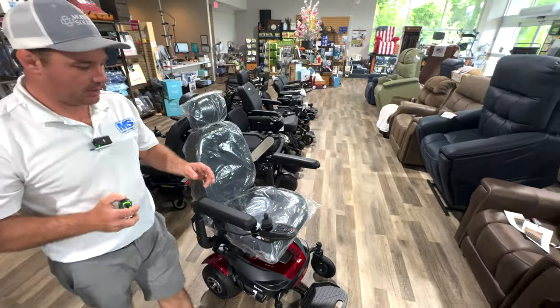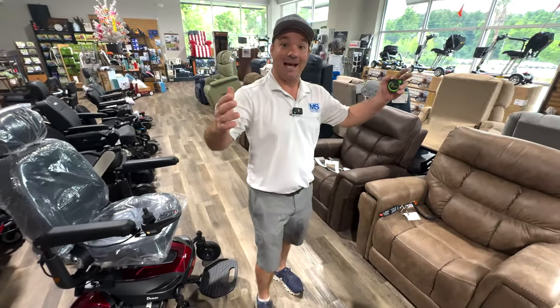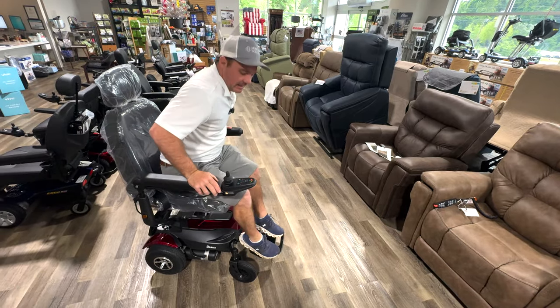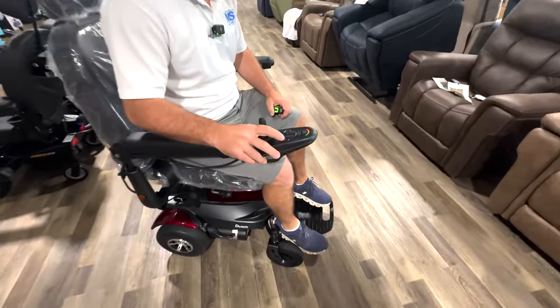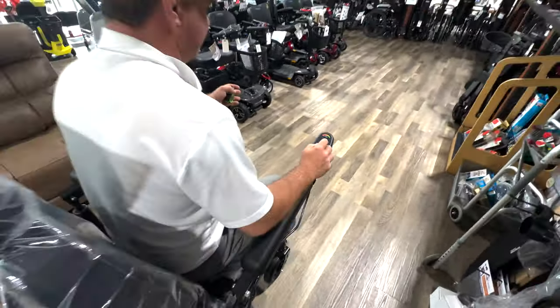Here's another reason you'd buy it. Let's say you have a narrow bathroom and you're able to get in there. You press this button to turn it on, and now you can drive it.